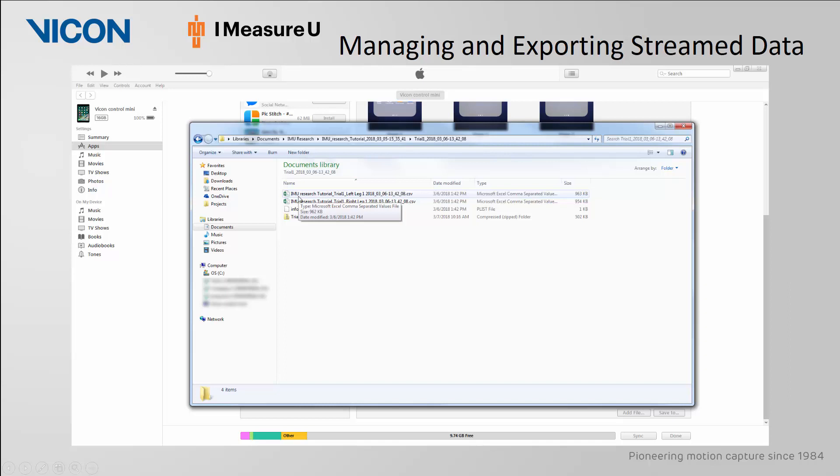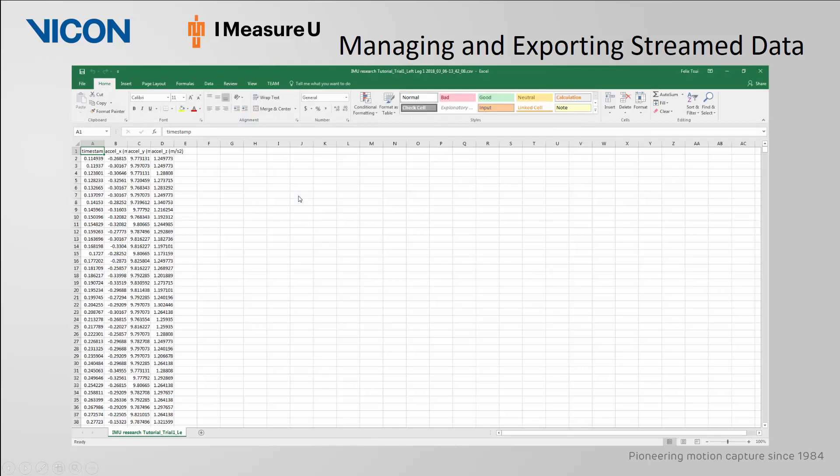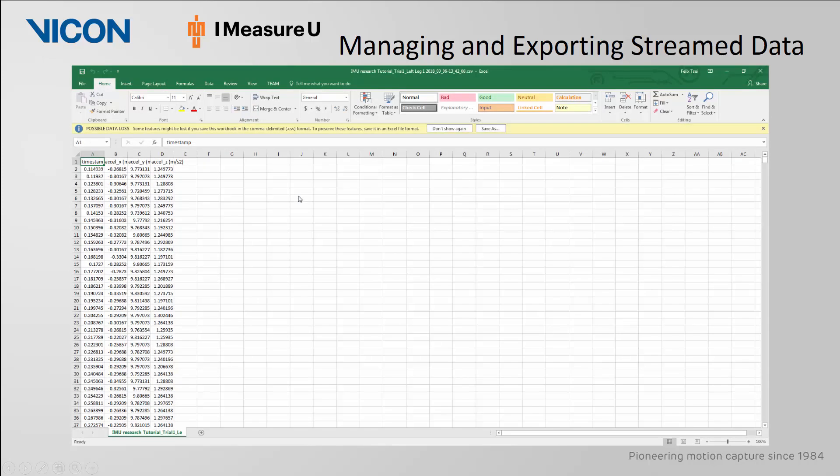If we open up the trial, we will see timestamp information and accelerometer data for the X, Y, and Z components.